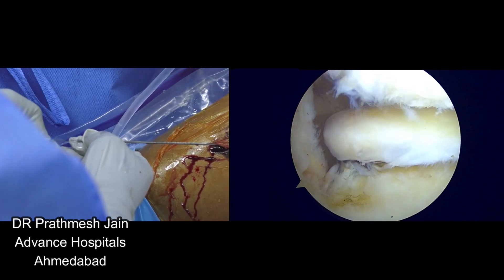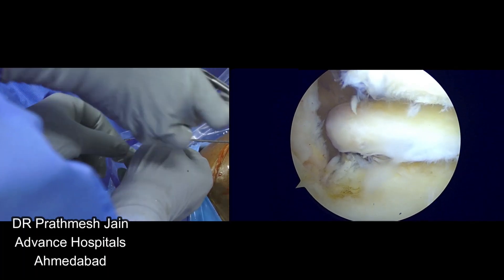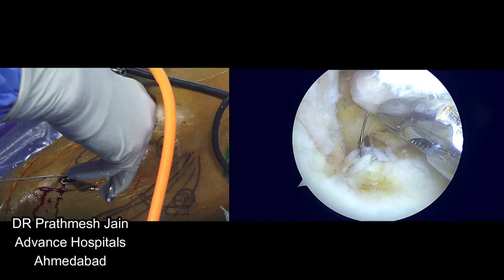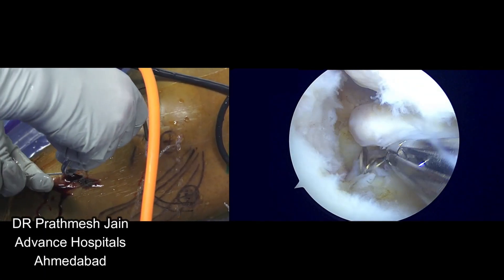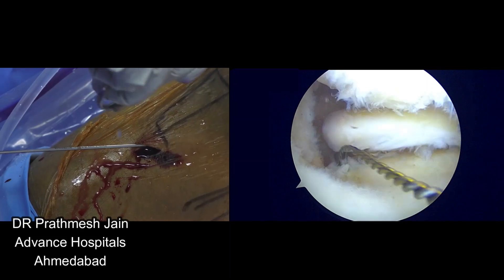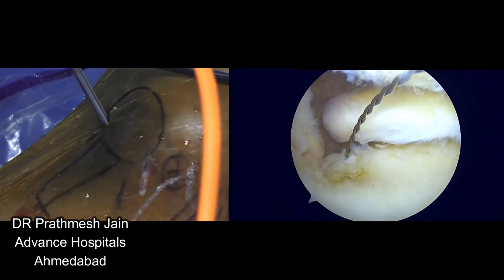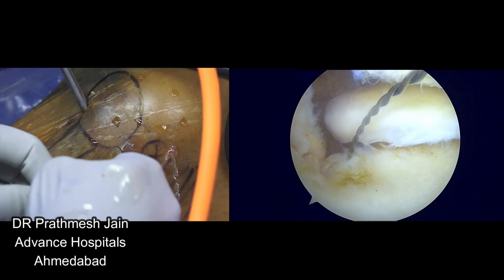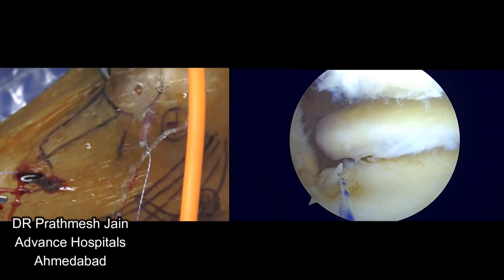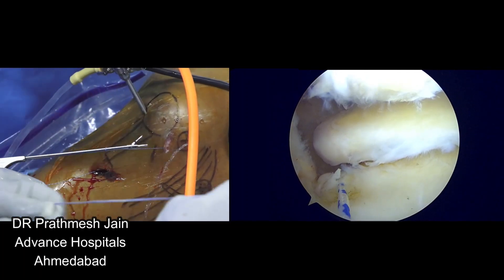The system comes with a nitinol wire. You can see here that the spinal needle is here and the nitinol wire is here, and I'll just pull the nitinol wire into place. Initially we used to pass the root fix anchor directly through this wire, but we had occasional breakages of the nitinol wire, so we have added one more step and added this lupin suture which is very strong, and you can pass the anchor without causing any issues.